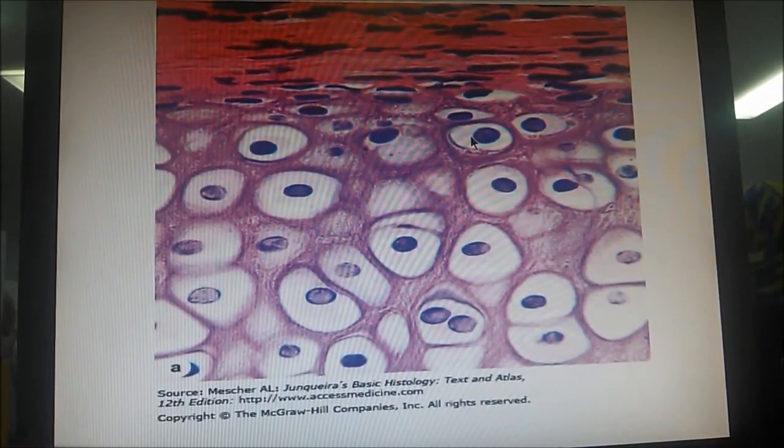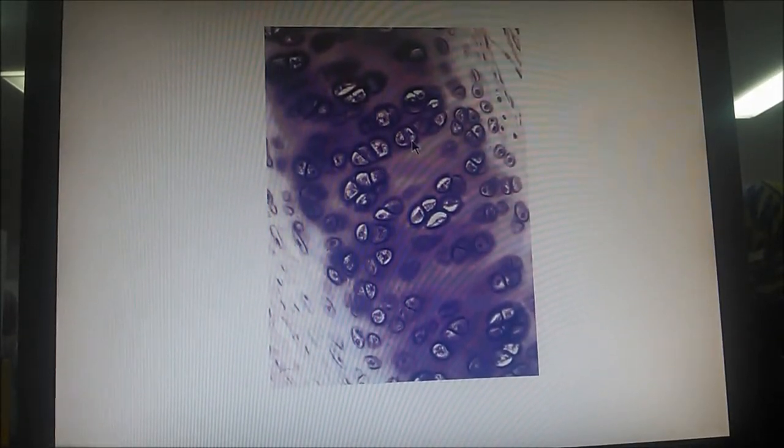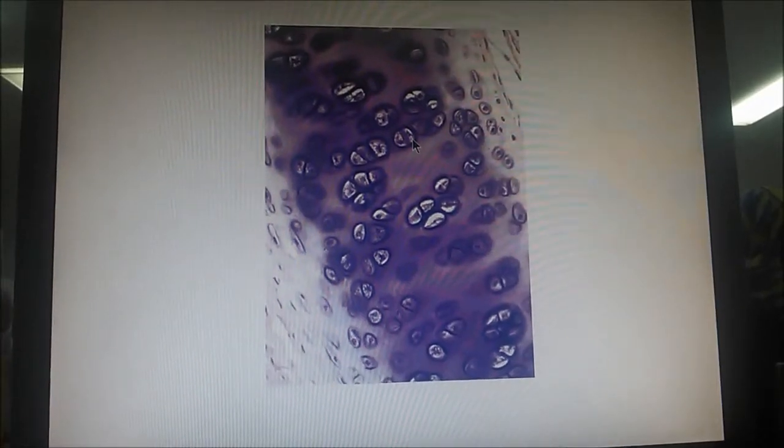Okay, the final maturation. Here this is a very famous photo. Also hyaline cartilage. هاي الchondrocytes بس لأنه الزوم صغير the nuclei is not very clear. اوكي بس الخلايا مبينة زي الايفوري زي الصدف. Here's the matrix. زي ما انتم شايفين هون كثير واضح انه الماتريكس اللي حوالين الكوندروسايت very basophilic, very dark, territorial. The remaining of the matrix paler, interterritorial.